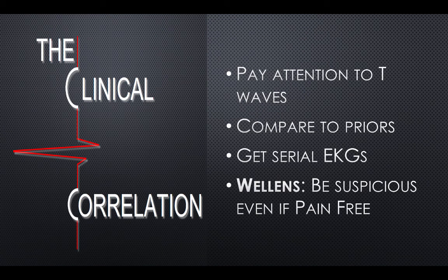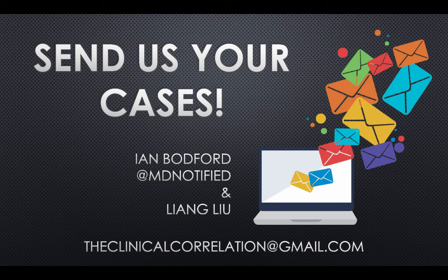So in summary, pay attention to your T waves on EKG. Always compare to a prior if available, and if uncertain, always get serial EKGs. And be aware that with Wellens syndrome, patients can be pain-free. However, with critical LAD lesions, these patients are high risk for morbidity and mortality. So that's our first case.